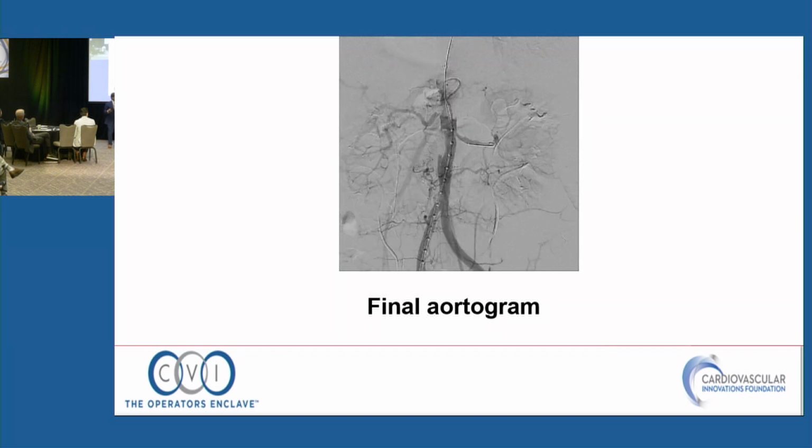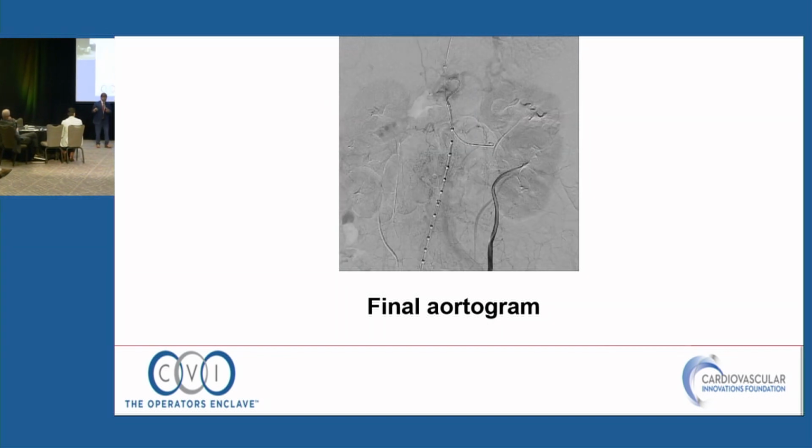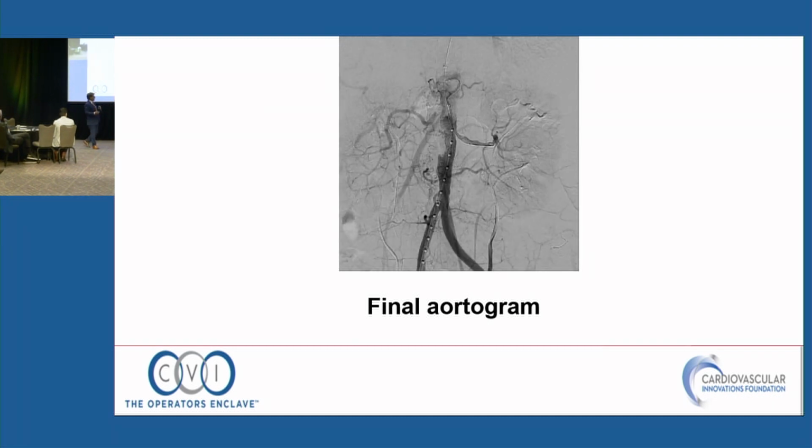And there's a lot that goes into that. Okay, it's just a stent, right? Well, there's a lot of preparation for it, the IVUS. What is your bailout? What are you going to do if things go poorly, and so on?